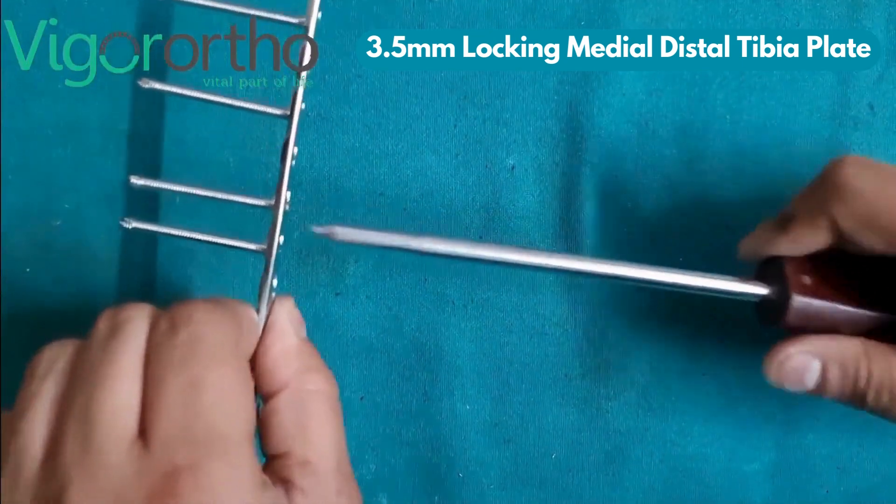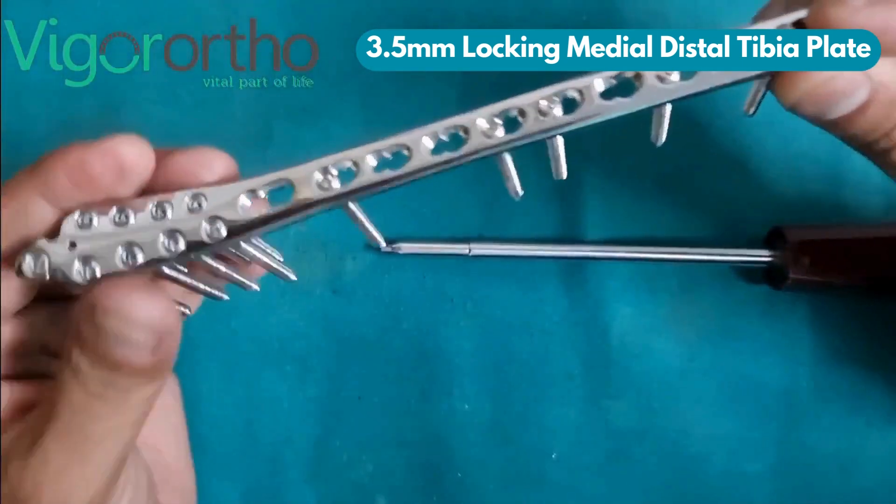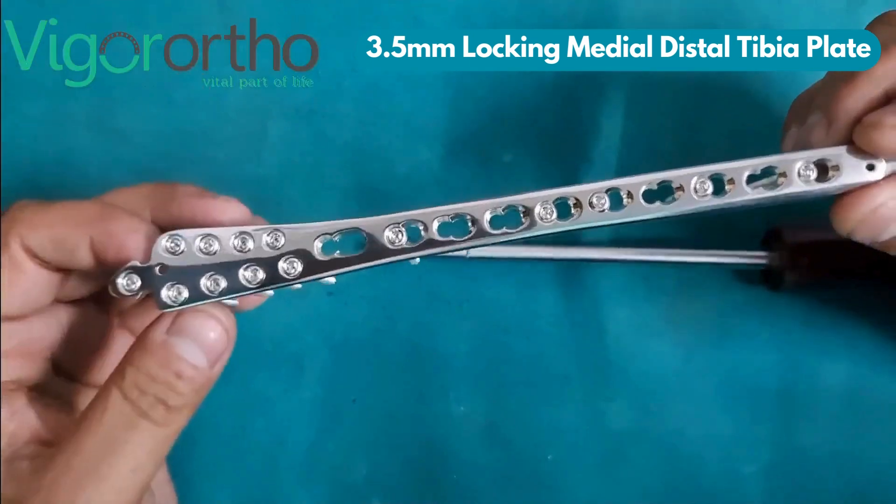Its low-profile design is intended to minimize soft tissue irritation and improve patient comfort post-surgery.